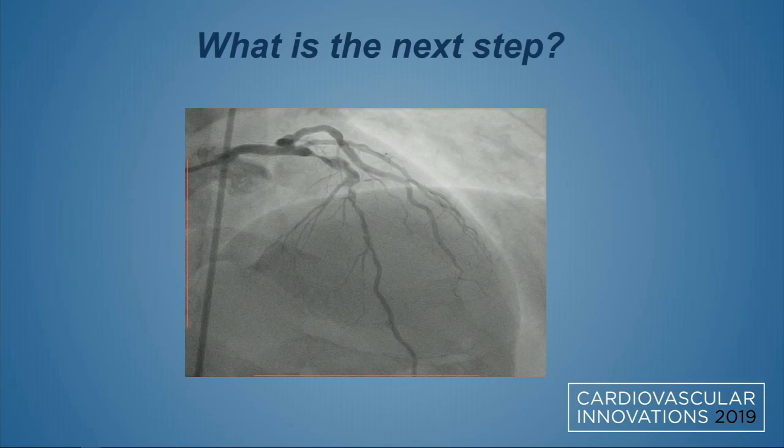4.0 proximal, and then 2.75 to the distal, and we did post-stent dilatation with 4 proximal and 3.5 distal. And you don't have IVUS in your institution? No, but that can always be done. Okay. So any additional comments?